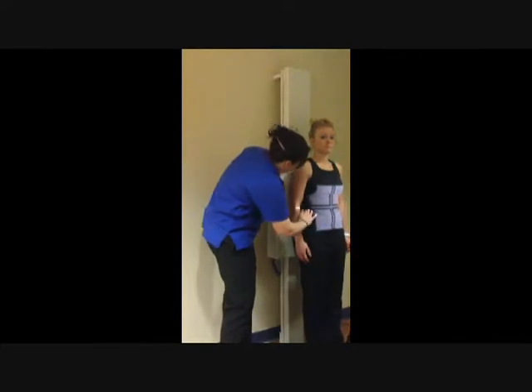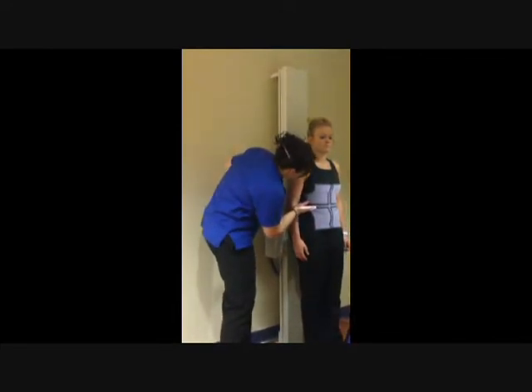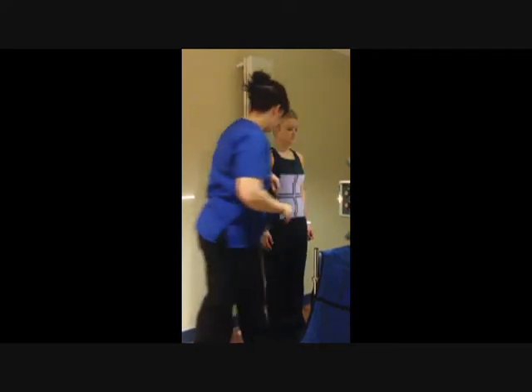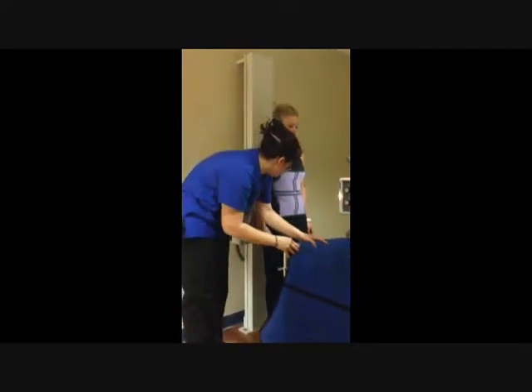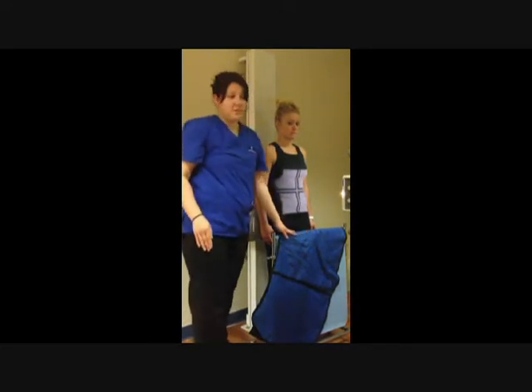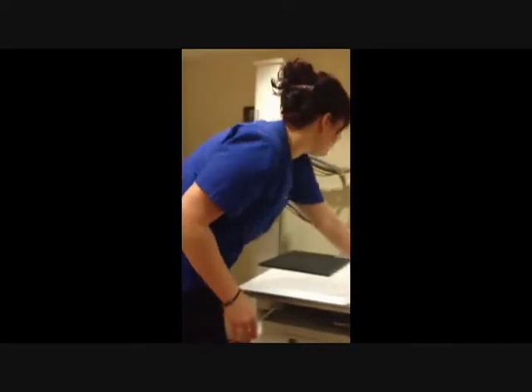So we need to center at the height of the iliac crest. We want to make sure that mid-sagittal plane is also right down the center of the image. This gets them nice and centered. What we're going to do then is put a shield right in front of them to help protect some of the femurs because that's where your blood is made.